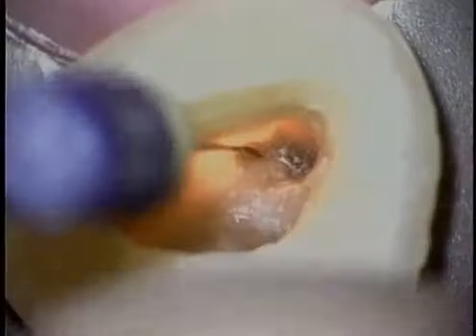Solvent-filled canals begin to show us the anatomy as it bleaches tooth structure and removes organic debris. Notice the arc of that isthmus area, reflecting the external surface of the underlying root. The working film shows the instrument moving through multiple planes of curvature and at length.